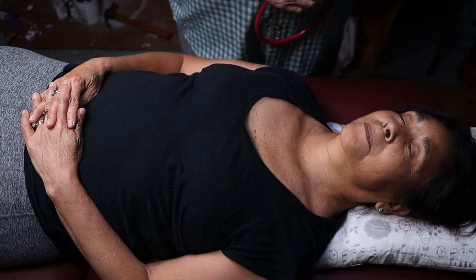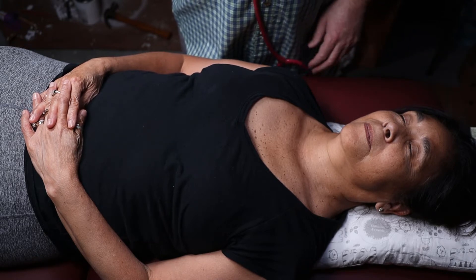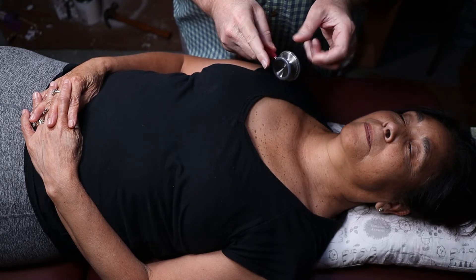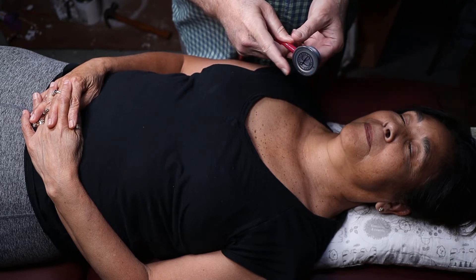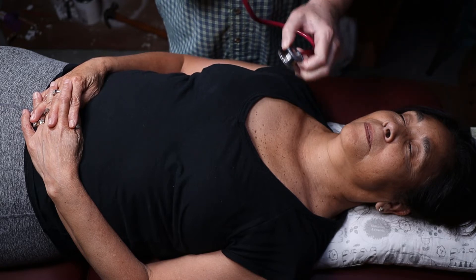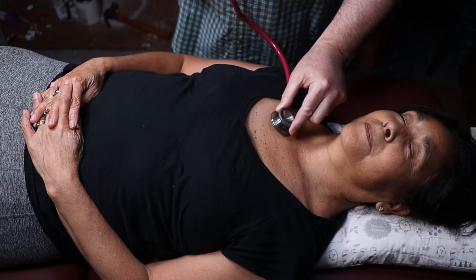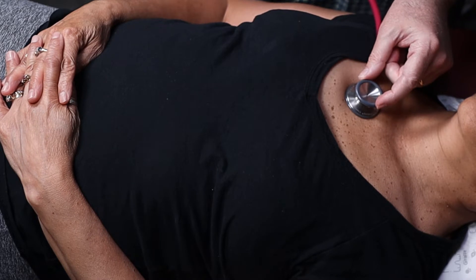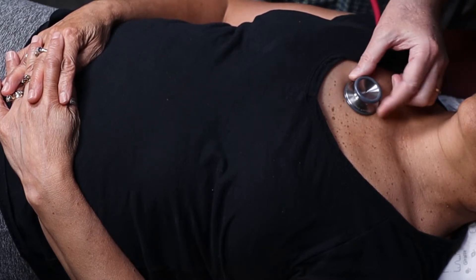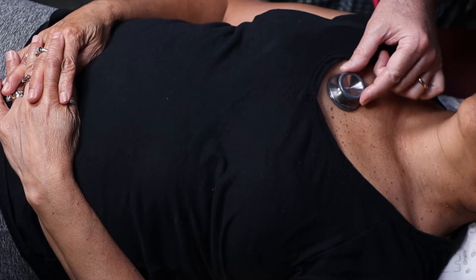This is the precordial area. If I say auscultate the precordial area, that's going to be a general auscultation. It's best that you show the examiner that you're not on the bell — we want to do this on the diaphragm. Notice the clavicles right here. You do not want to have your diaphragm up that high; that's the first intercostal space and you're going to get points off. It should be down about a half a diaphragm length, about right there. So that's where we're going to start.